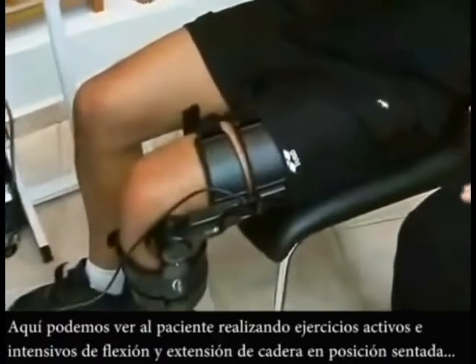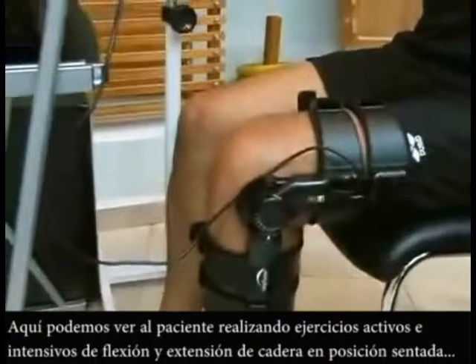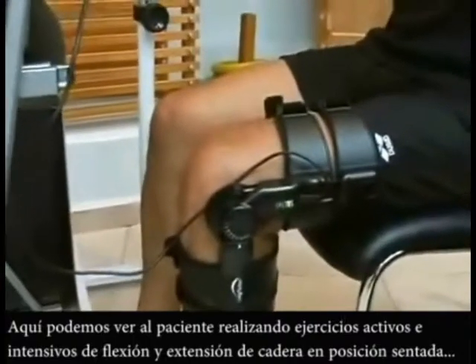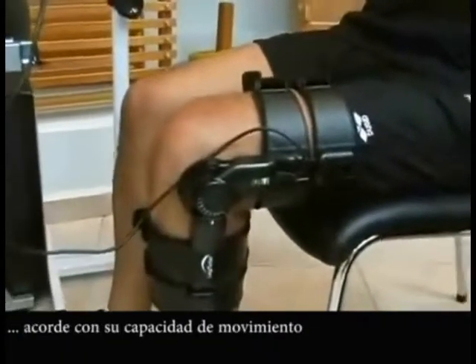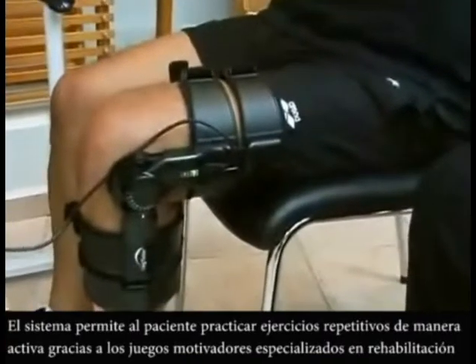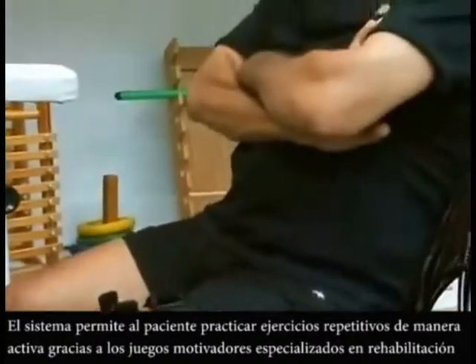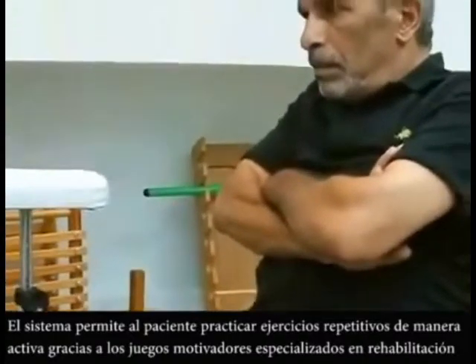Here you see the patient performing intensive active hip flexion and extension exercises in the sitting position according to his movement ability. The system allows the patient to practice repetitive active exercises in the form of motivating and challenging games.